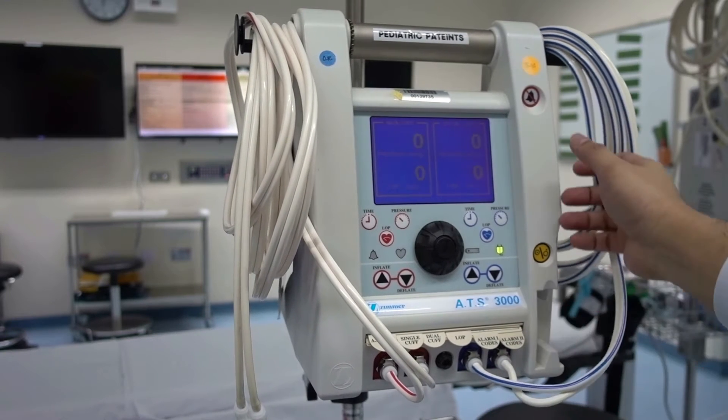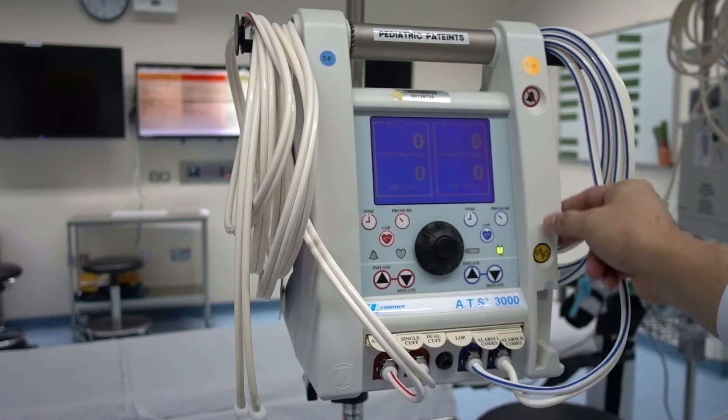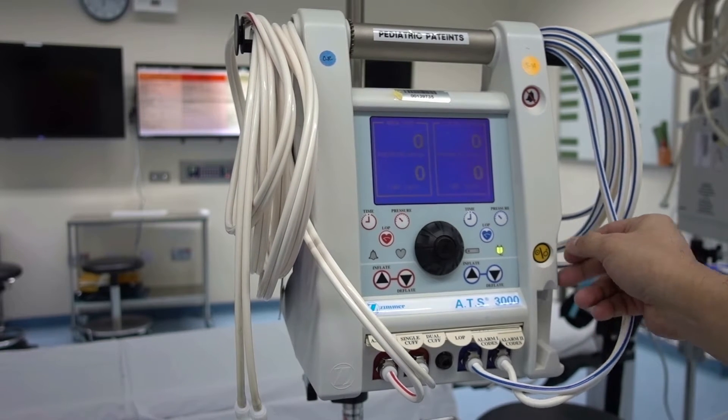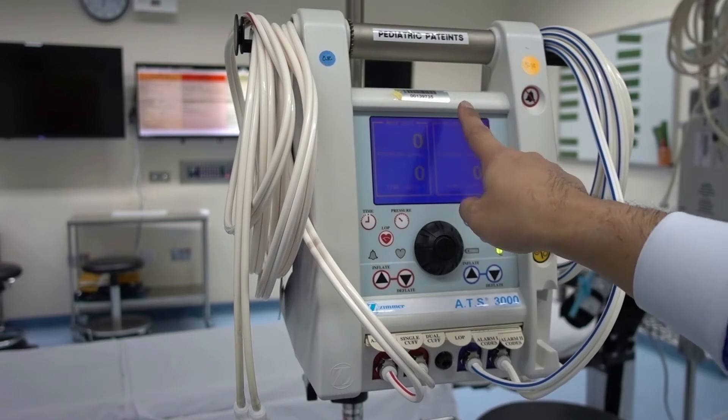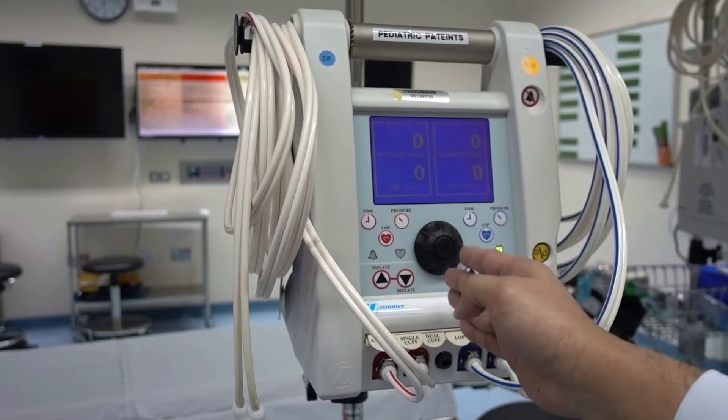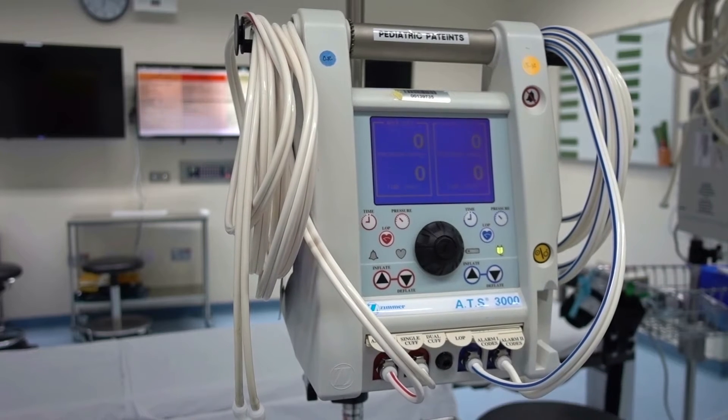On your right-hand side is where the alarm shut-off button is, and below that is the on and off button. The pressure setting on the right is for the blue cuff, and the control buttons for the red cuff are on the left side.